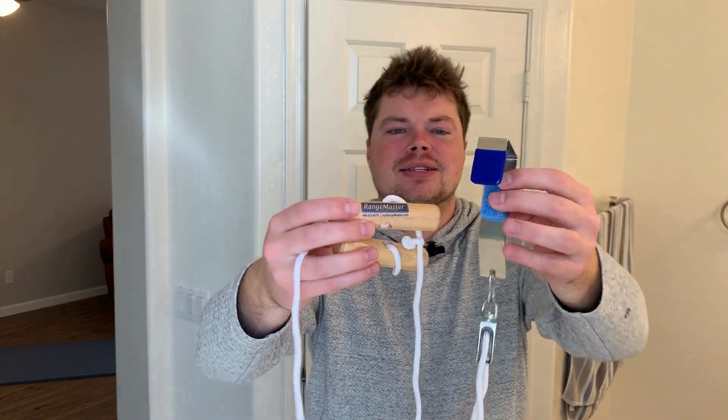Here I have the Range Master shoulder pulley. I'm going to show you how to install this device and also go through some frequently asked questions: what size doors does this work on, can you shorten the strings and if so how, and does it come with exercise guides? I'm going to answer all those questions for you and hopefully help you out with your purchase.